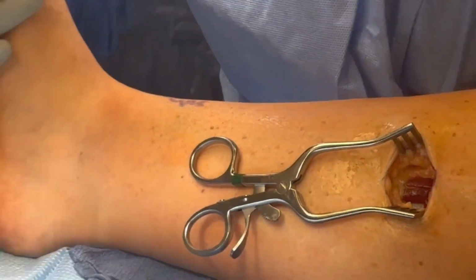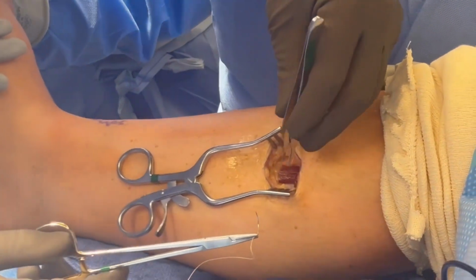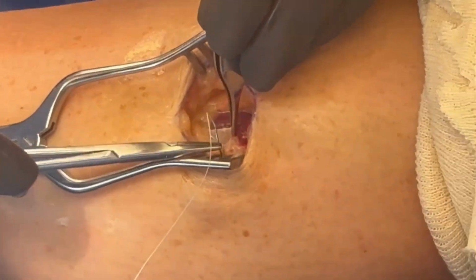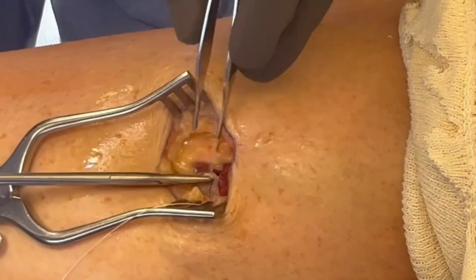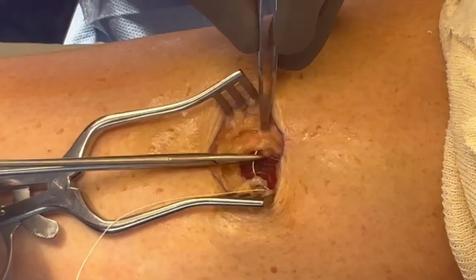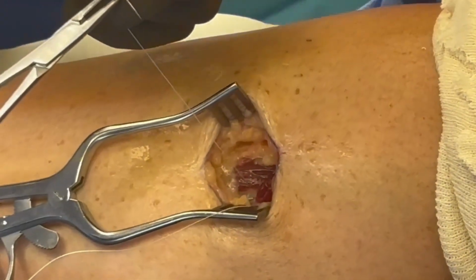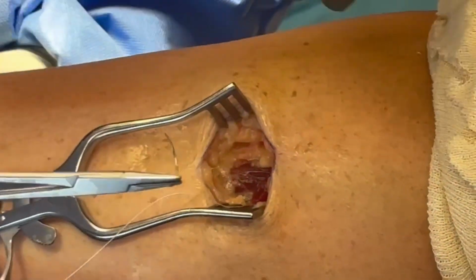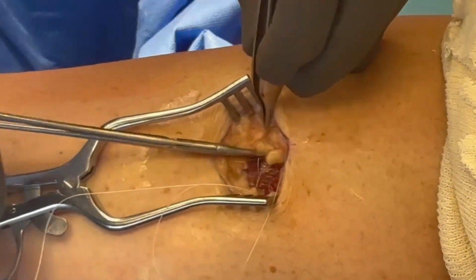You have to be careful of the saphenous nerve, which can be right on the fascia on the more anterior portion of the fascia. And if you see any fibrofatty tissue, that's usually where the nerve is. Just kind of push it more dorsally or anteriorly to get it out of the way for closure. And I typically just use some simple interrupted sutures, usually around 2 or 3 here to get this together.